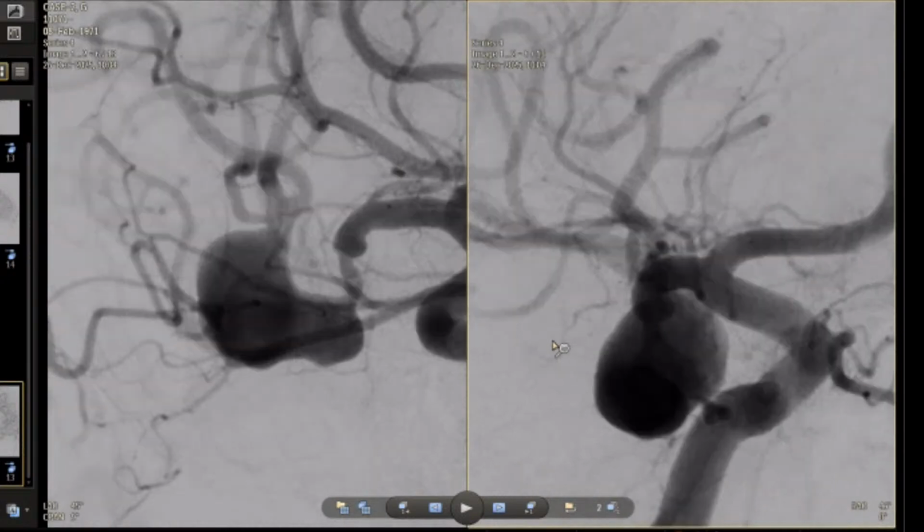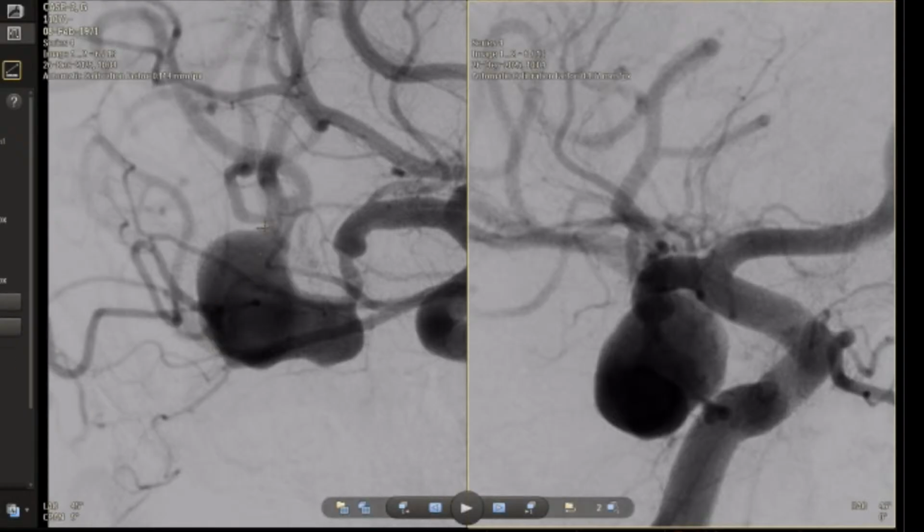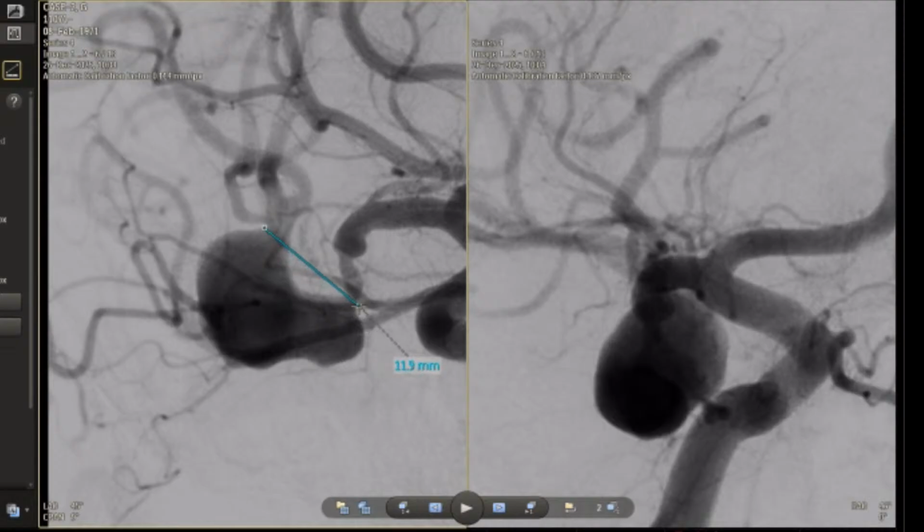And now we have this situation. For me, it's possible to do it in this way. This will be the stent, 24 millimeter, maybe 26. Usually it's 2 stents. So we have 3.5, 3 millimeter, 25 Leo Baby.